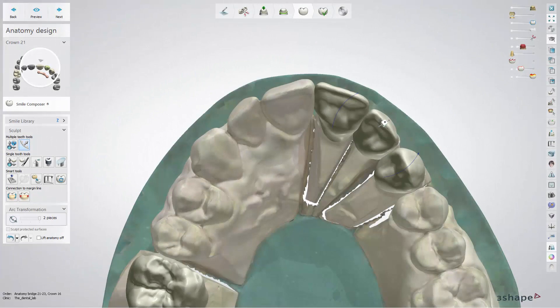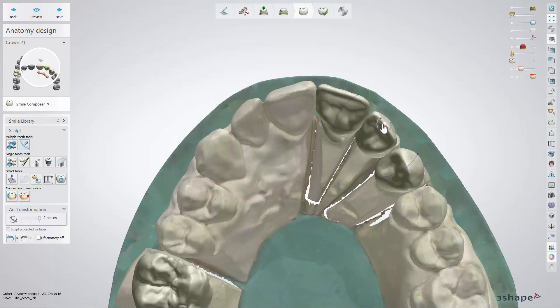If you want to scale or rotate a single tooth, hover the cursor over the selected tooth and its control point, then use the mouse wheel. Double click on a control point to change the mode.